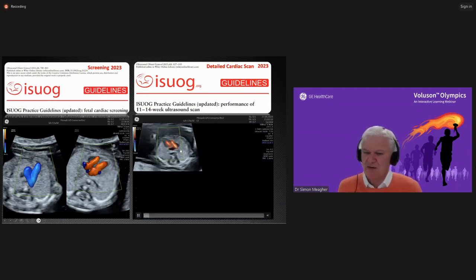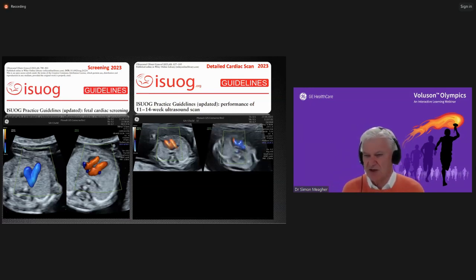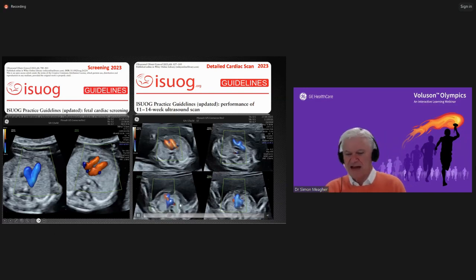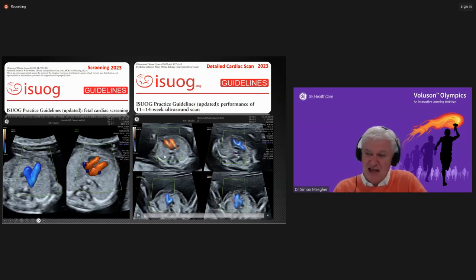If you want to go a little bit further in terms of doing a detailed cardiac assessment, as is part of the first trimester guideline 2023, well, then you extend it to including the left ventricular outflow tract after the 4-chamber, sweeping up to the 3-vessel and the 3-vessel tracheal view. So you will see there is additional information provided in these additional section images, which, if you look at it, look no different to how you look at the heart at the mid-trimester examination. That's where we are in 2023.